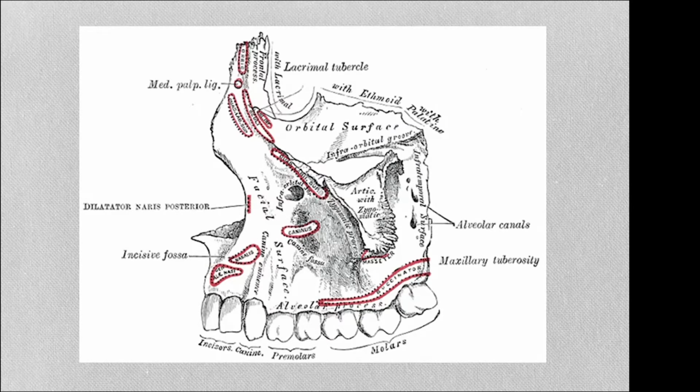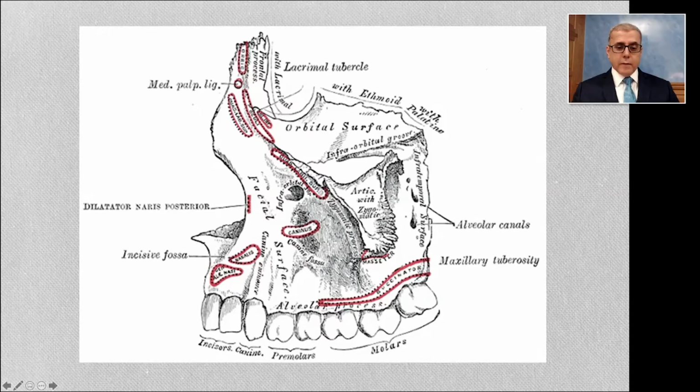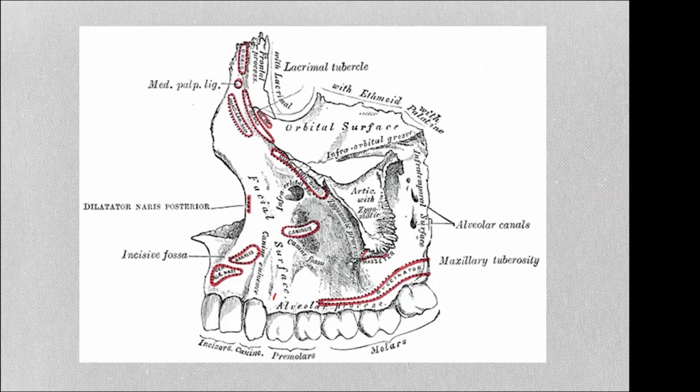What is important to us is this area, the area from, say, the first bicuspid or second bicuspid all the way to the second molar. The alveolar process is where we are working, and it says that right there in this nice script, alveolar process. The alveolar process is obviously where the roots are, and this is where the implant will need to be.